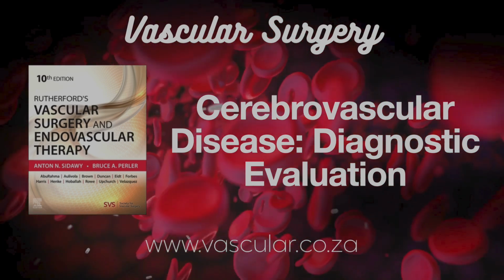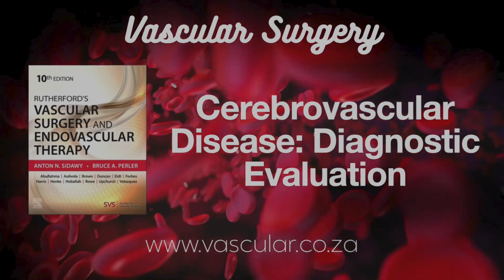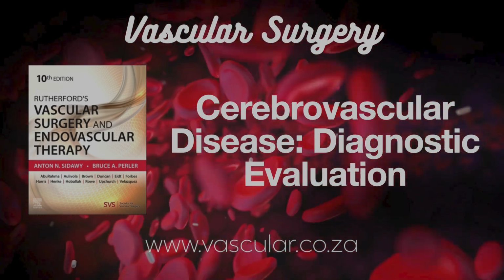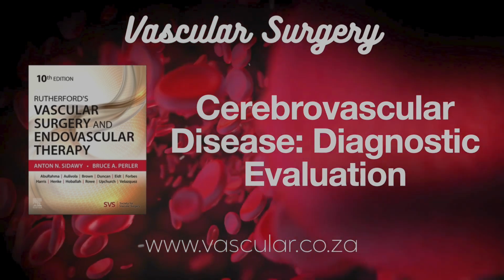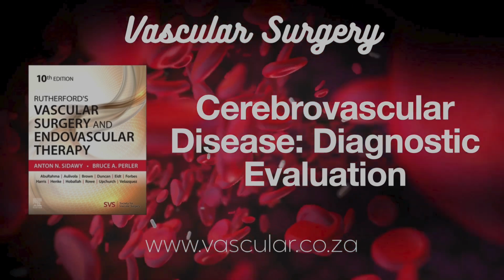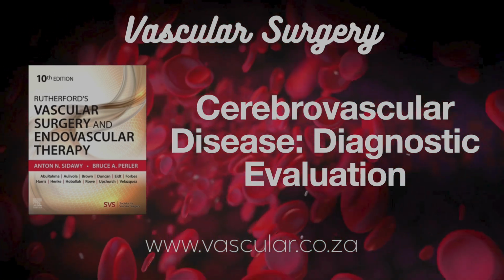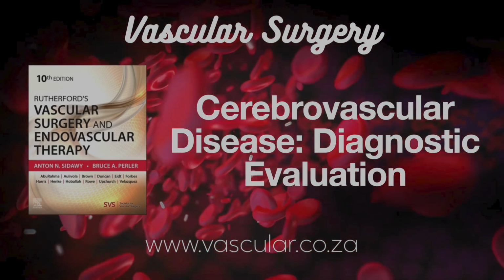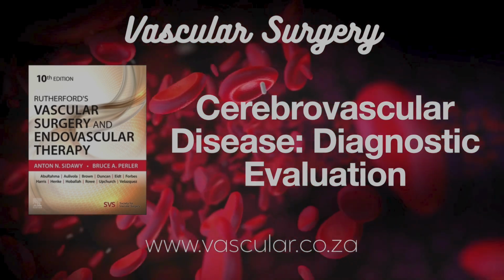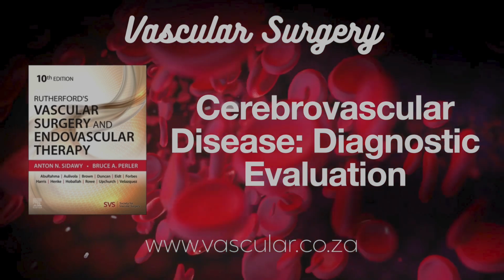Well, the Society for Vascular Surgery, the SVS, has pretty clear recommendations. The starting point, the initial choice for evaluating stenosis severity, whether you have symptoms or not, is duplex ultrasound. DU first. DU first, ideally performed in an accredited vascular lab, an ICAVL accredited lab, and interpreted by physicians experienced in reading these scans. Experience matters. Definitely. And if that DU study clearly shows, unequivocally, a 50-99% stenosis in someone with relevant symptoms, or a 70-99% stenosis in someone without symptoms, that's often considered sufficient information to make a decision about intervention.